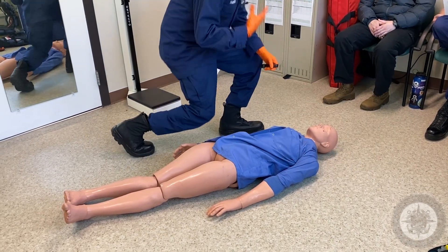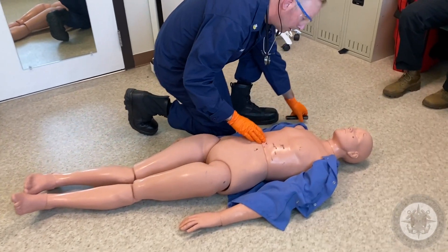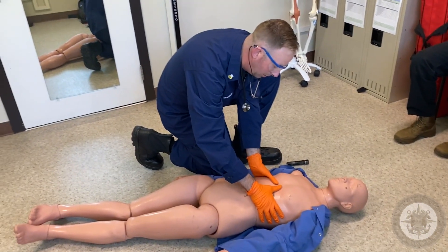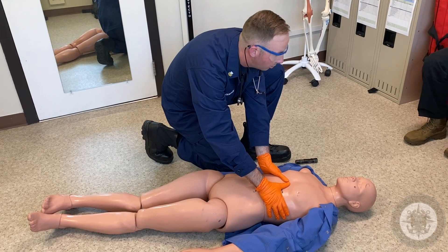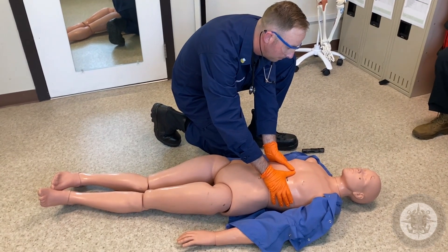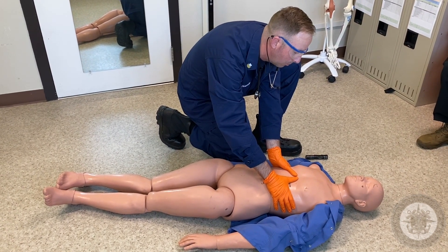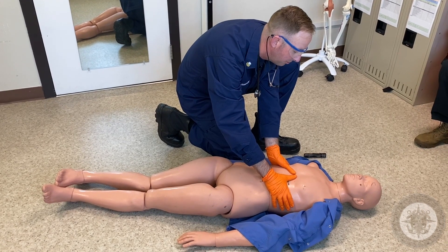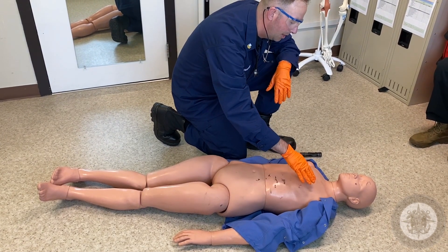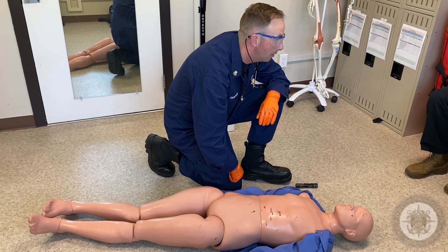Moving down to the chest. I'm going to expose the chest and check for rate, rhythm, quality, and tidal volume. They're breathing at 18, regular and unlabored. With that information, I'm going to put them on a non-rebreather at 15 liters per minute, and then assess for any secondary injuries that may affect the airway.